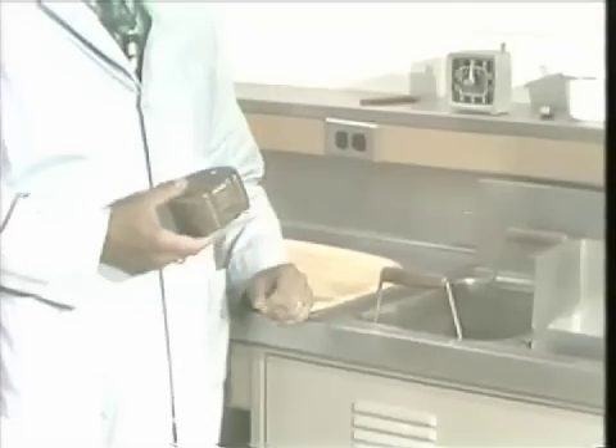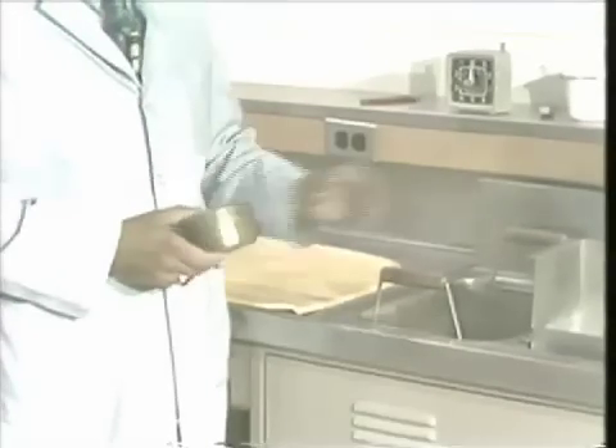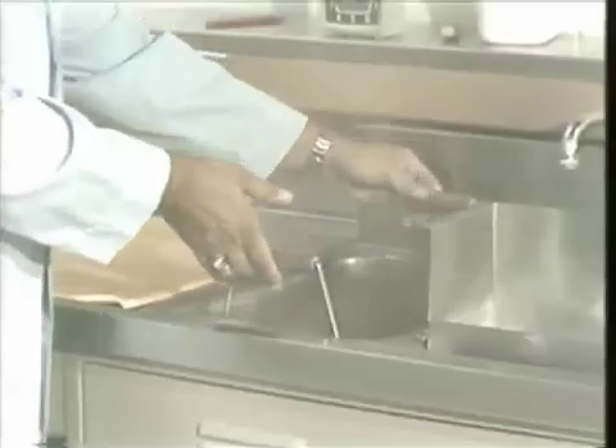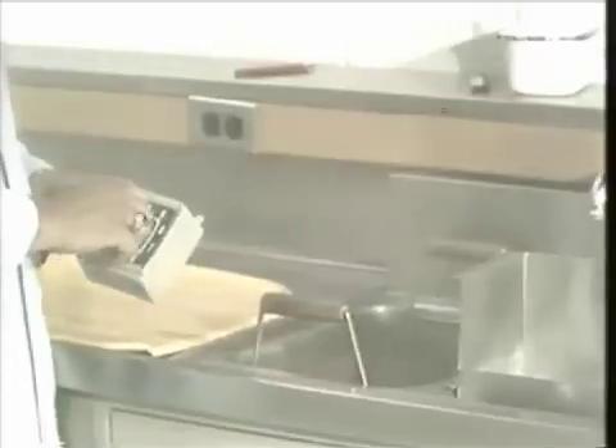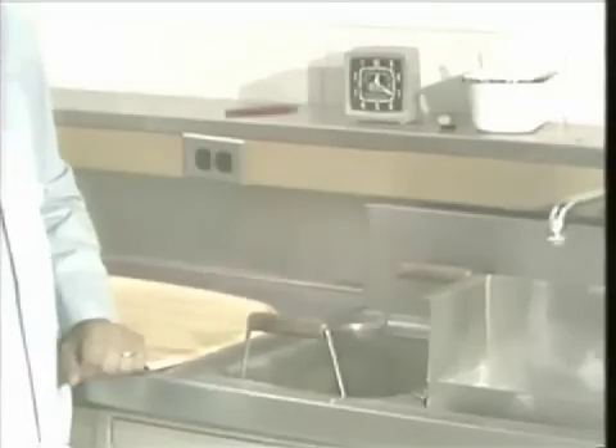We're going to be using the maxillary denture in the flask, and I'm now going to place it in the first tank of water. We'll leave it in this tank for seven minutes. For convenience, you can use a timer. After seven minutes, we'll remove it from this water bath.